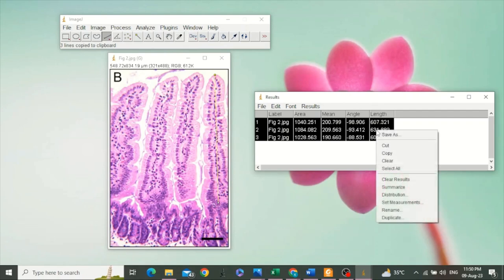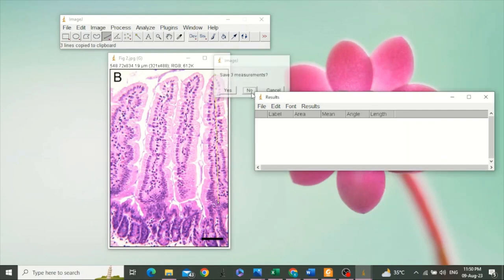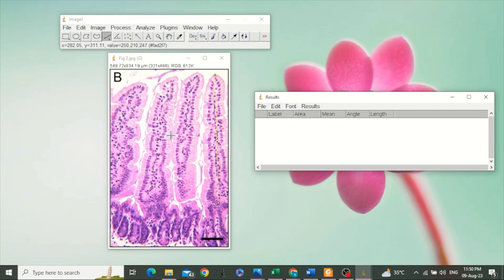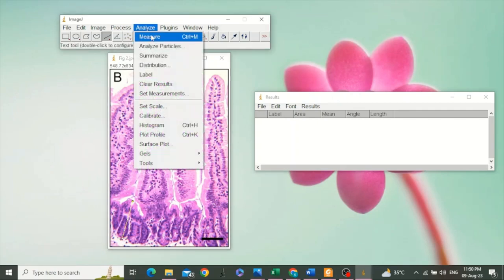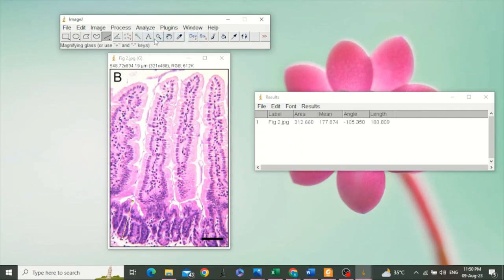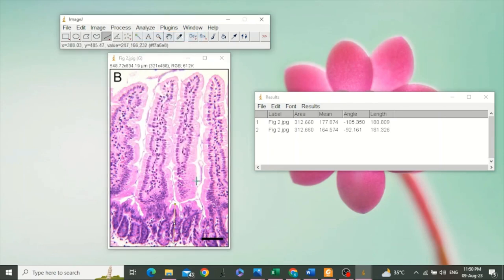Now we can clear these results. The next thing is we can measure the depth of the crypt by drawing a line starting from its opening to its base. Go to Analyze, select Measure. We will take another measurement. Go to Analyze, Measure.